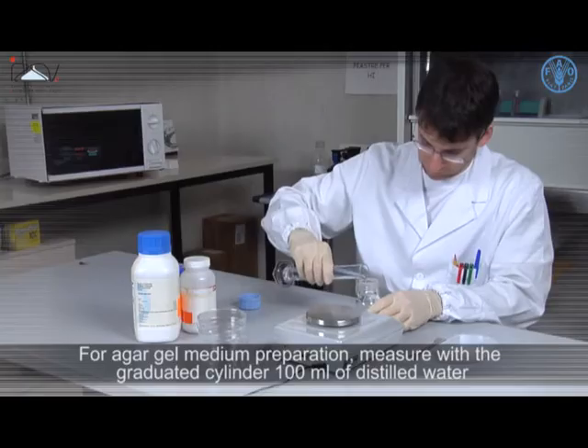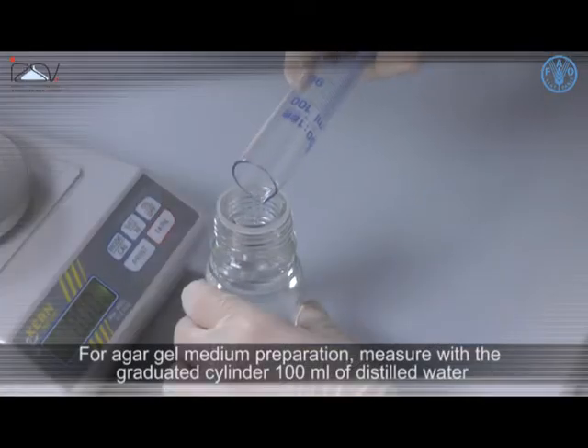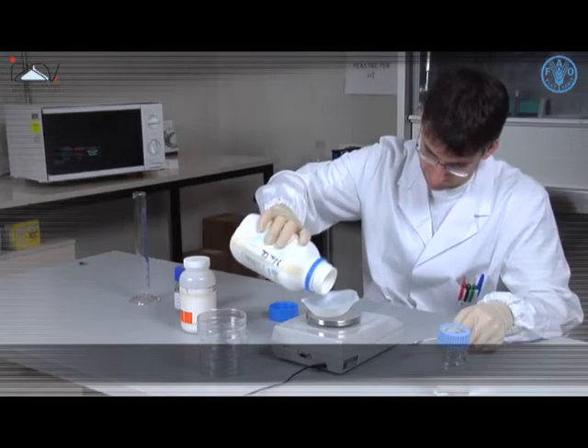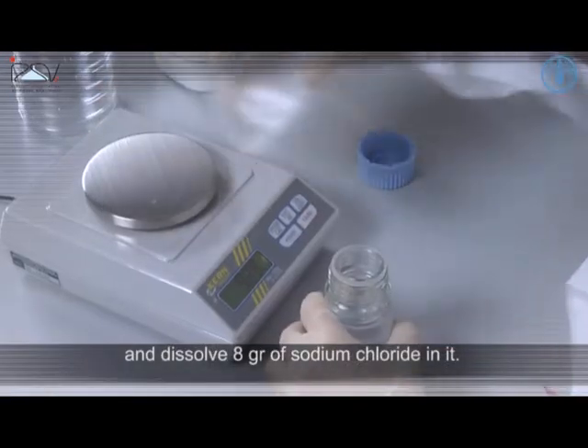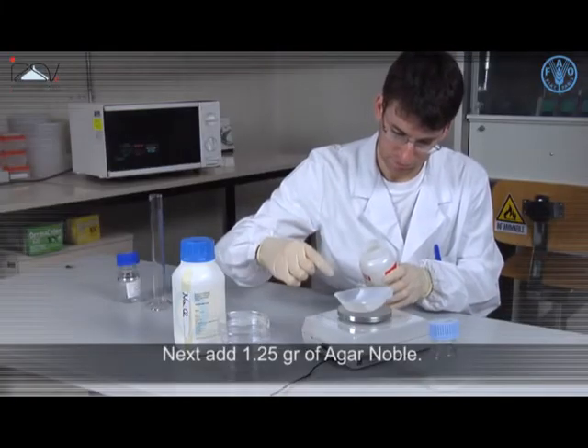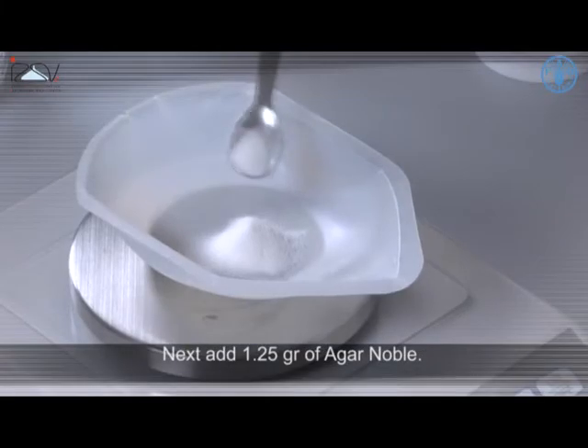For Agar Gel medium preparation, measure with the graduated cylinder 100ml of distilled water and dissolve 8g of sodium chloride in it. Next, add 1.25g of Agar Noble.